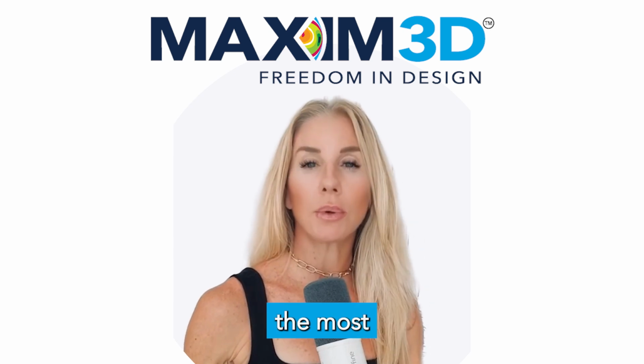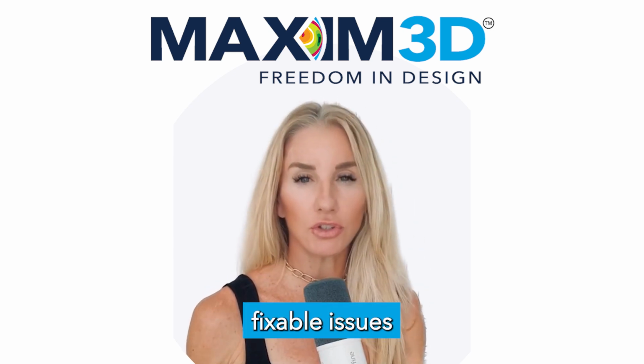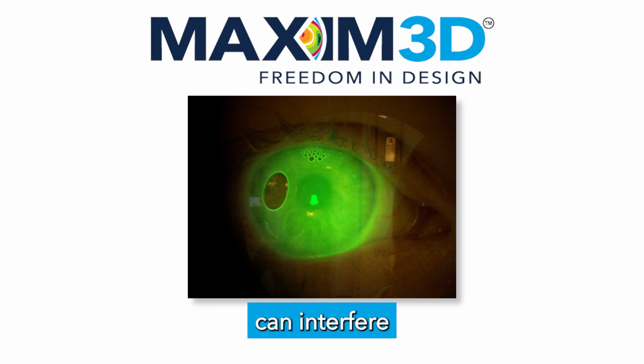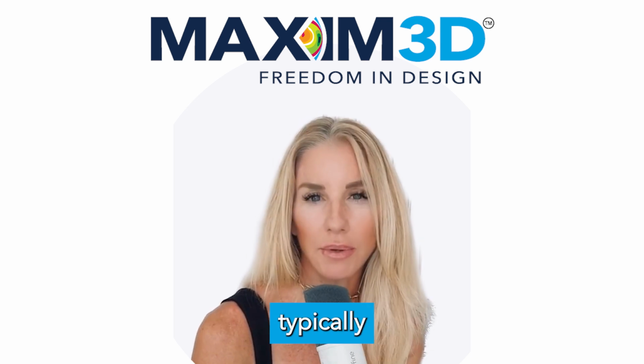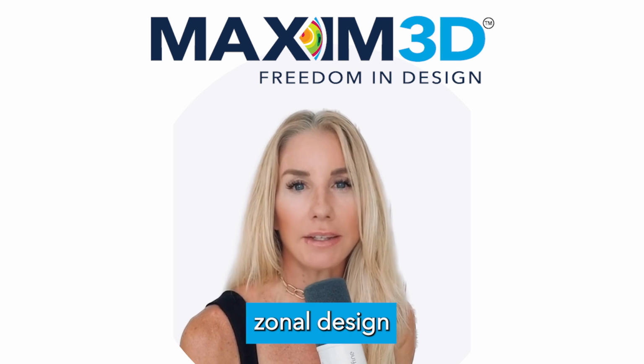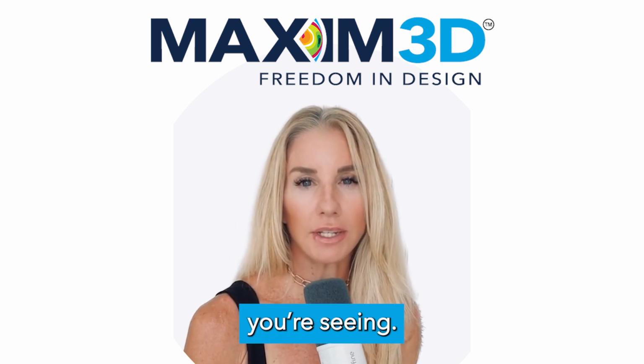Let's talk about one of the most common and easily fixable issues in scleral lens wear: bubbles. Bubbles can interfere with vision, cause dryness, and signal a mechanical flaw in the fit. Here is the good news. They're typically straightforward to troubleshoot using Maxim 3D's zonal design system. Let's review what you're seeing.